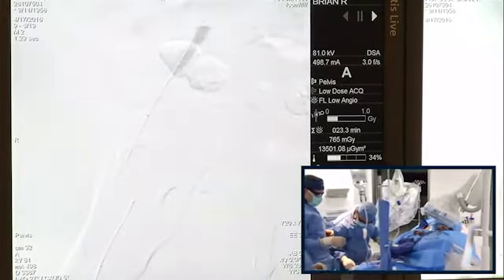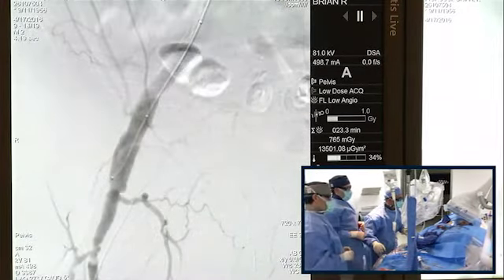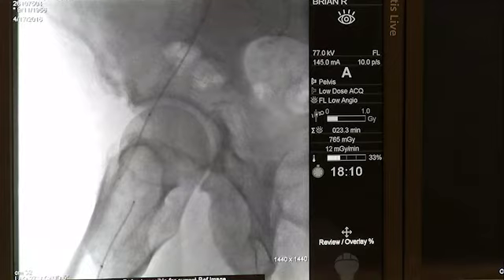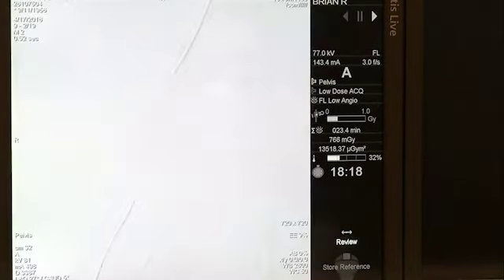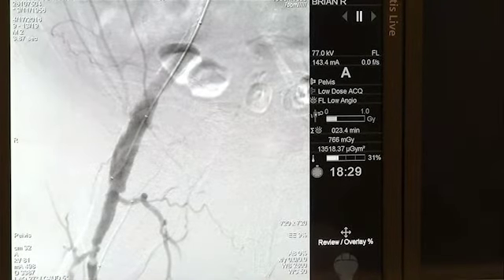But what I'm going to do, I'm going to use the roadmap here, reference this. Okay, so what I want to do, I want to turn this towards this side. Put the roadmap, please. Yeah. It didn't go on. Let us put the roadmap. You see the knob is right there at about 4 o'clock, if you agree. Yeah, but to be honest, I'm not so sure whether this is really the true origin.